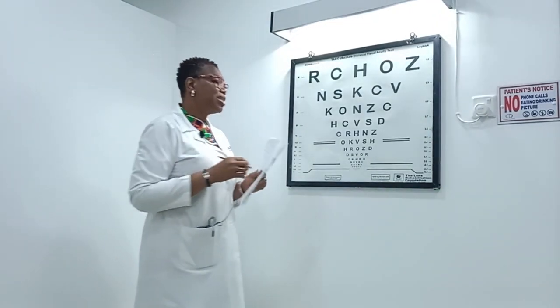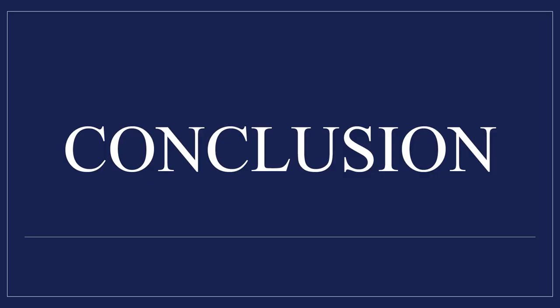So we're going to get a telescope of 4x magnification. So we check our devices, what we have in the clinic, what is available, and let's see how this can take her to 0.1 logMAR on the charts. Okay, so at the end of the day, we're able to make out what she needs to be able to carry her task out efficiently while at work.